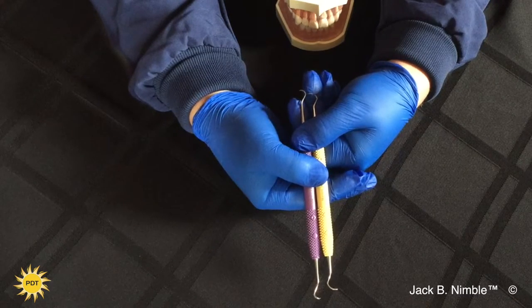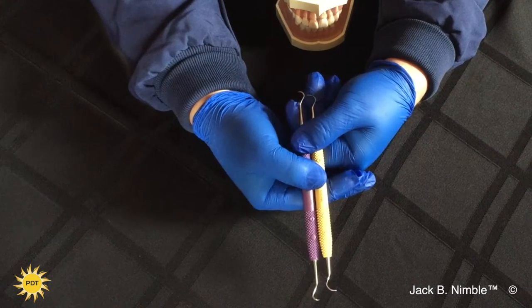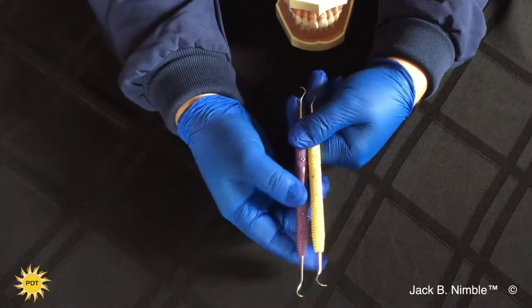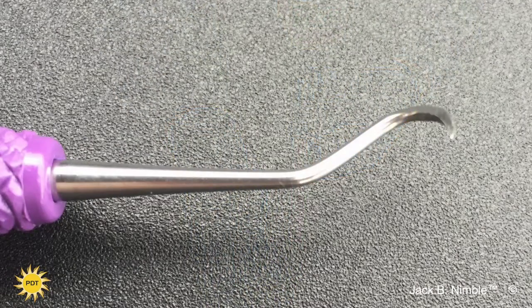Our number one selling Montana Jack is now available in a mini design called the Jack B Nimble. The Jack B Nimble has a slightly longer functional shank and the blade is shorter with a tighter curvature.